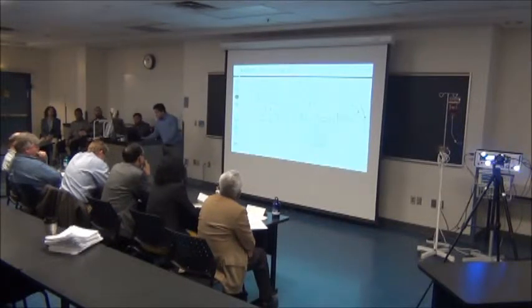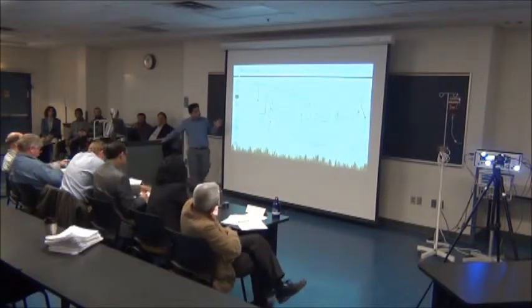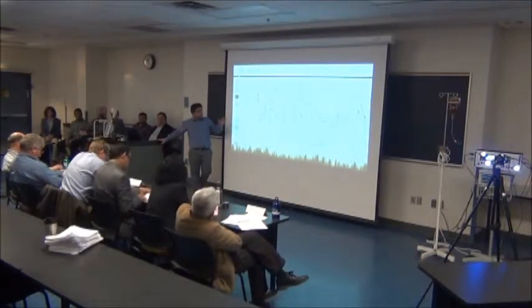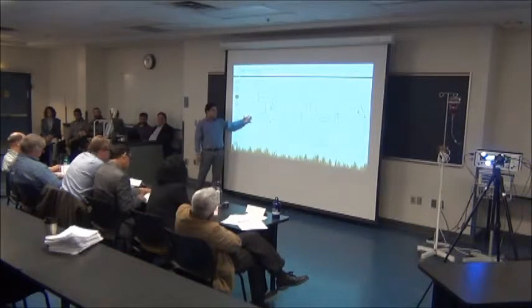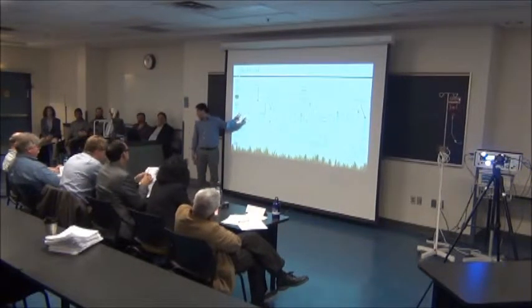This is the main circuit. The circuit has excitation, and it takes the output from the patient simulator at the signal in, the waveform in.